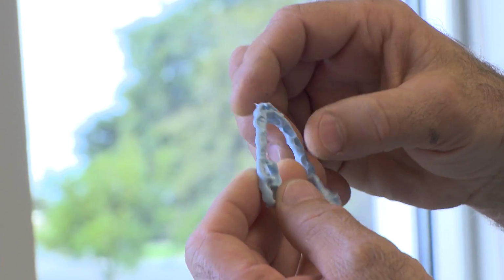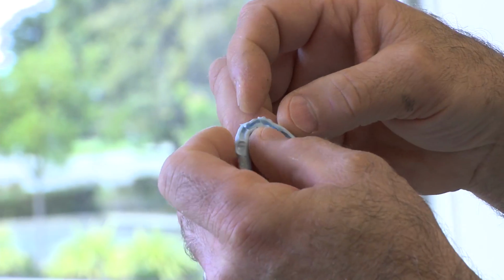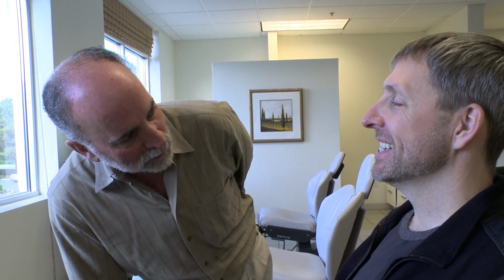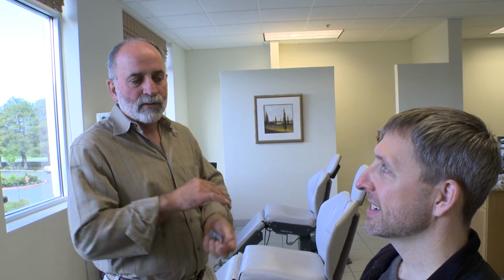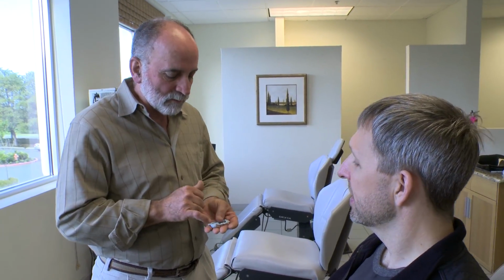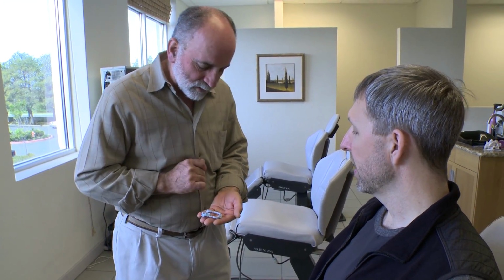But we've come together pretty good in the front. We look like we're hitting maybe just a speck heavy on your right front tooth. But pretty good. Let me look at the big picture. Bite close from there. Let's see how everything's growing here. We're getting down pretty close there. If we were in that night piece more often, those teeth would be able to grow in quicker. But you stayed quite stable here. Everything's pretty good, just one little speck on the outside and a little speck on the front.